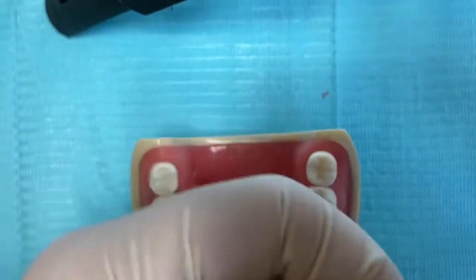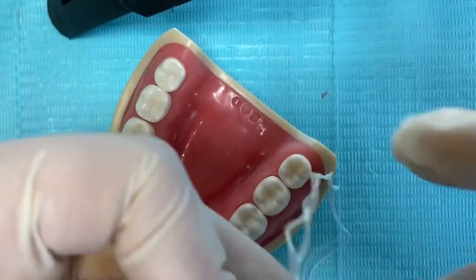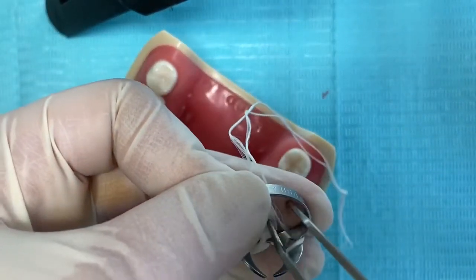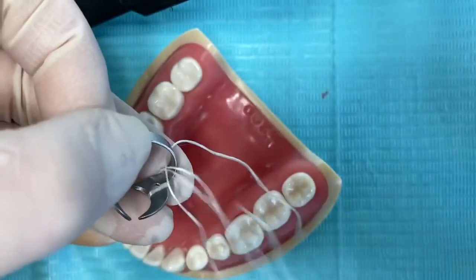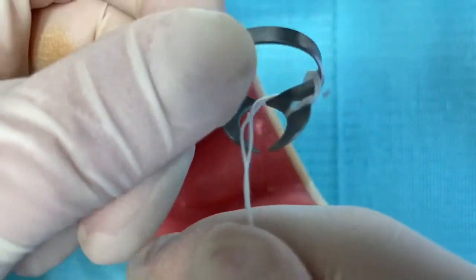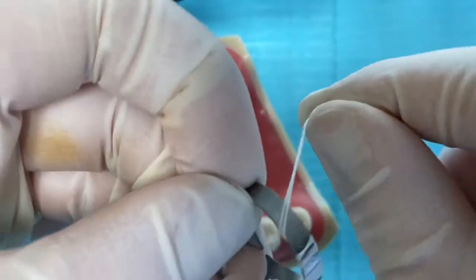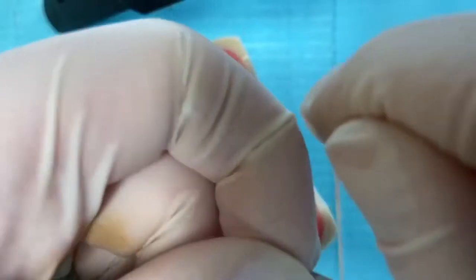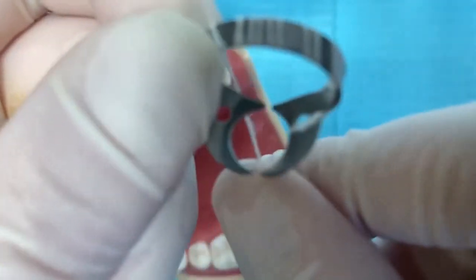I will not just suffice with one hole — I'll make it go all around the bow. I'll pull it out with a tweezer to make things easier, then rotate it again, bringing it closer, rotating multiple times all around the bow, going to the opposite side. We'll insert it in the other hole on the other side of the jaw, come out, and then make another tie.